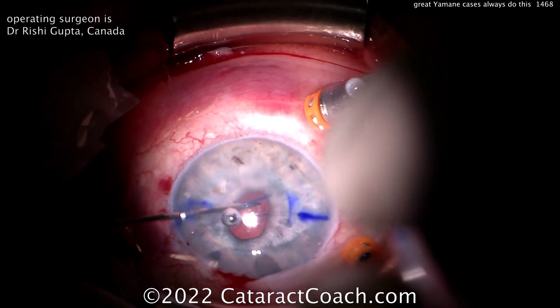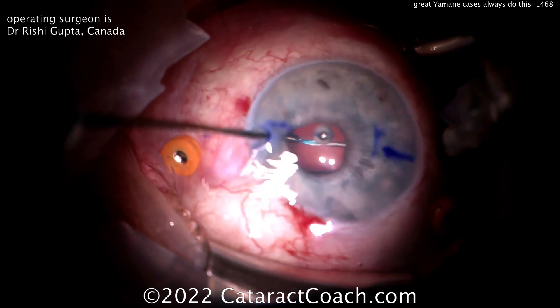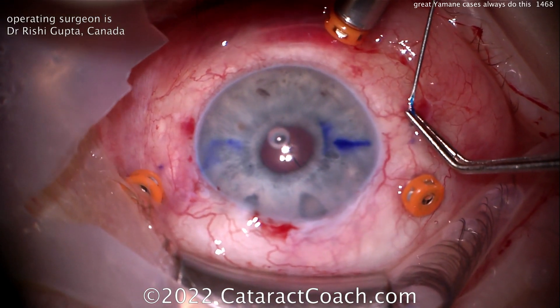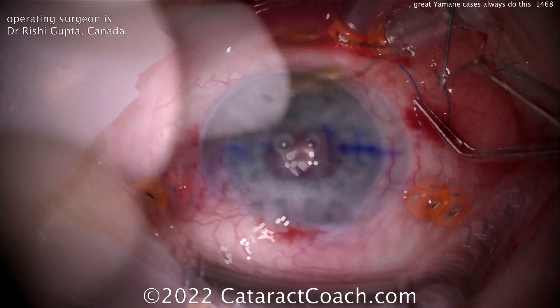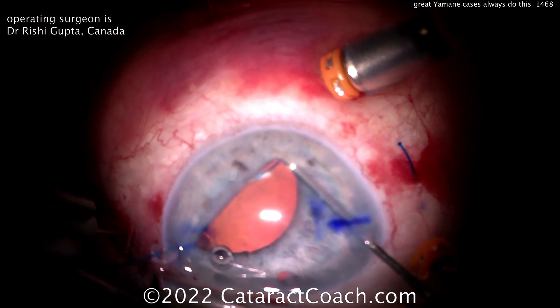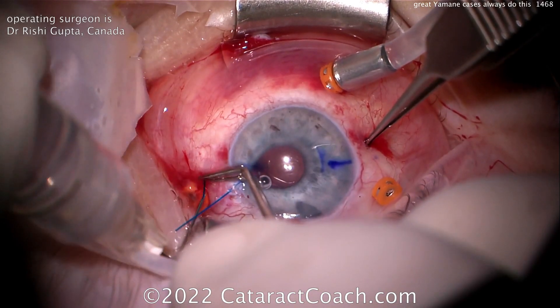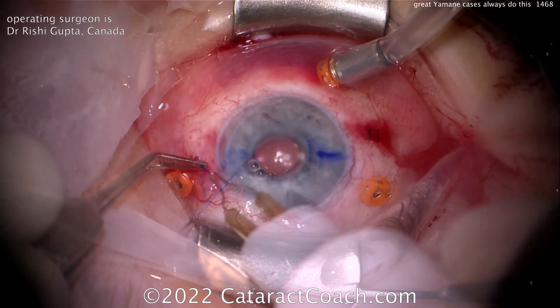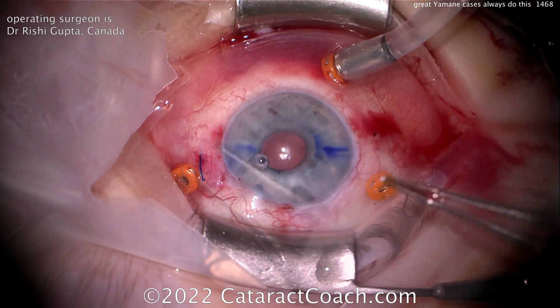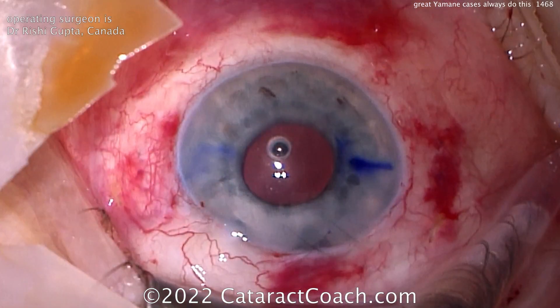So now he's going to get this Yamane done very appropriately. There's no vitreous left in the eye, no entanglement of vitreous. He did a full and complete pars plana vitrectomy because he's a retina specialist. Pulling that haptic out now looks great. He'll use that low-temp cautery to create a little flange and do the same on the other side. A beautiful technique — he saved this case and also switched to a more appropriate lens, the Zeiss CT Lucia, which has haptics more amenable to this procedure. Make sure you get those flanges deep in that intrascleral pocket — that looks like a great case.